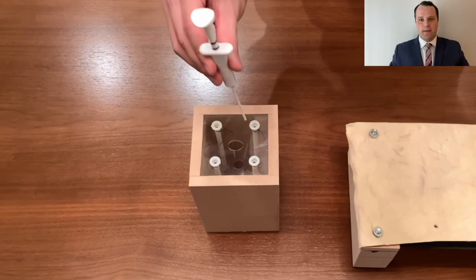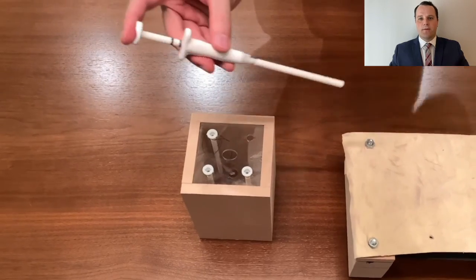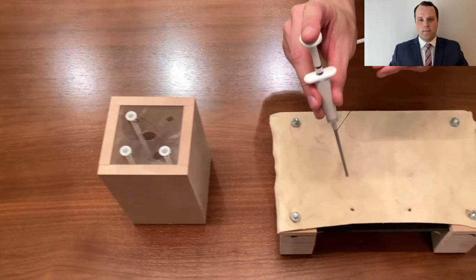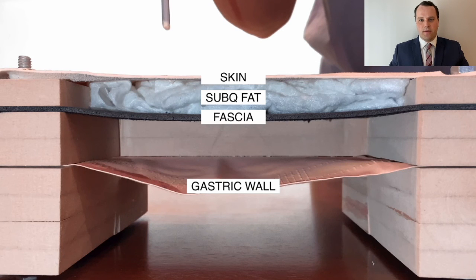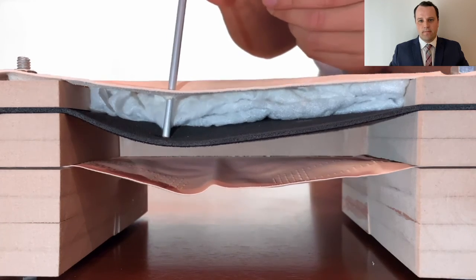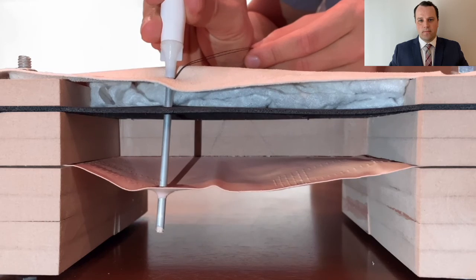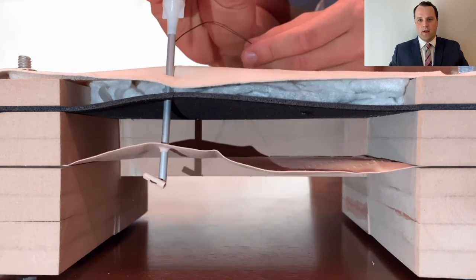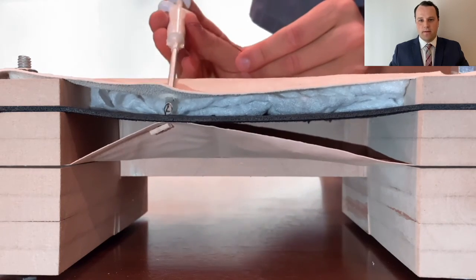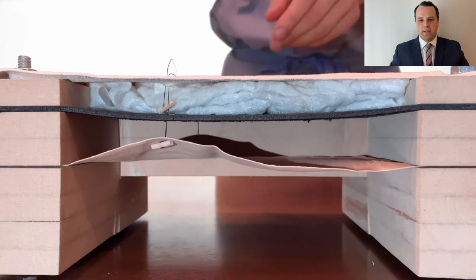Our latest prototype is demonstrated in this ex vivo model of gastropexy. The first needle is loaded onto the plunger. The needle passes through all layers of the abdominal wall and into the stomach. The plunger is depressed and the first anchor is deployed. The needle is withdrawn to the subcutaneous space, and the plunger is depressed again to deploy the second anchor. The needle is removed from the patient and set aside.